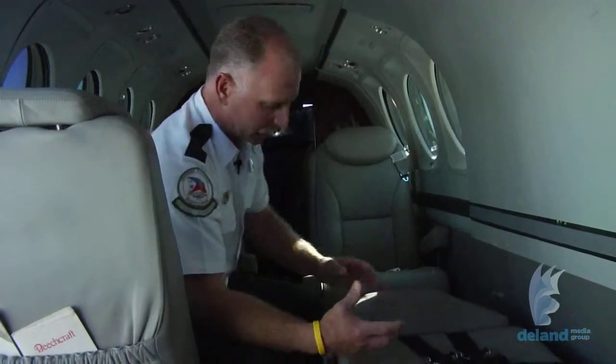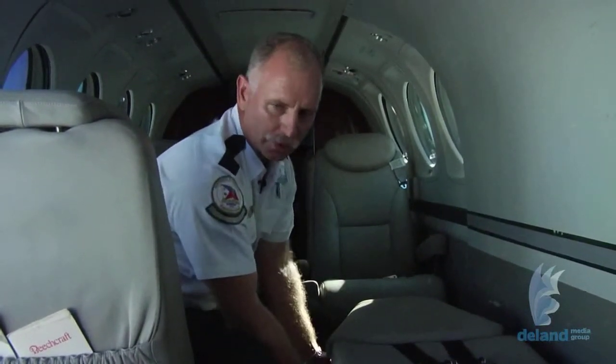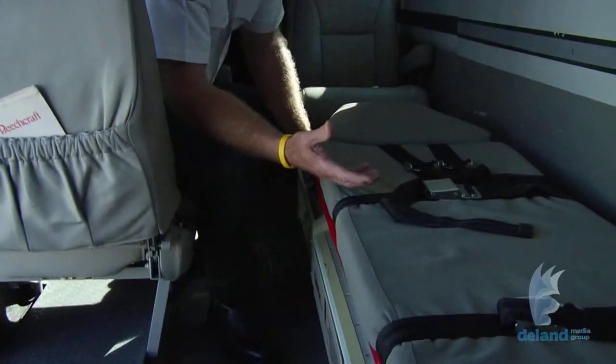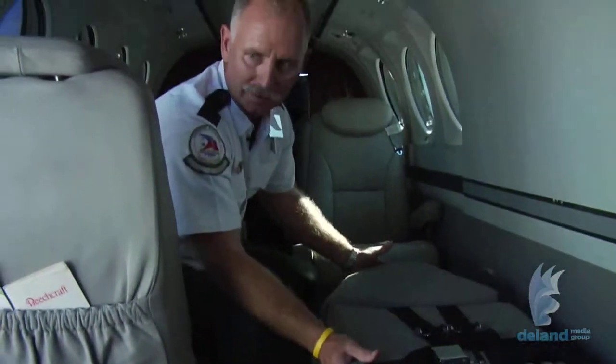It's got an air compressor on it. The air compressor would be used to assist in operating the ventilator. So if we need air, if we need oxygen, if we need power, everything is self-contained on this sled, which you would not normally have in an airplane. So that's why it's specifically designed for an airplane. And each one of these is designed for the airplane that it's in. If we're using a different kind of airplane, then we're going to use a different type of sled. It's going to have a little bit different mounting configuration, and the wiring is going to be a little bit different, but it's going to do the same thing.